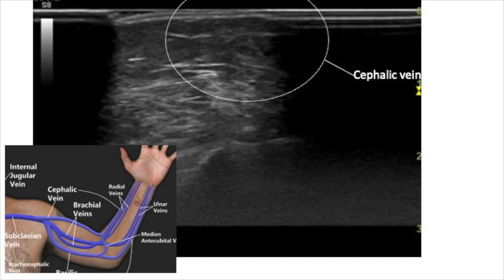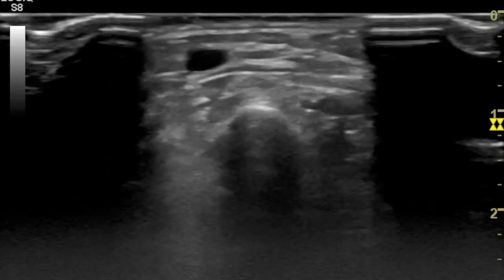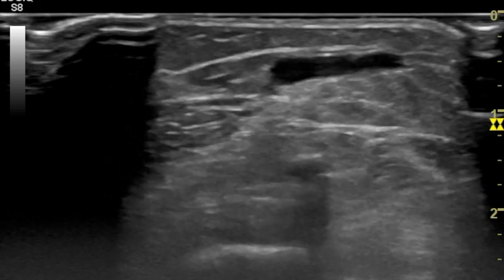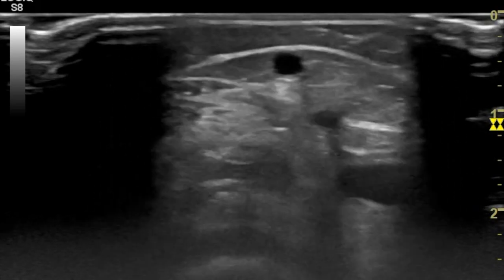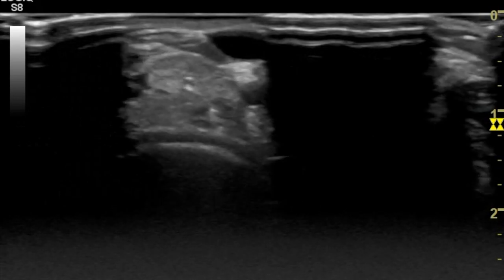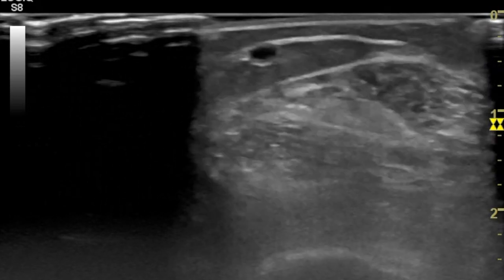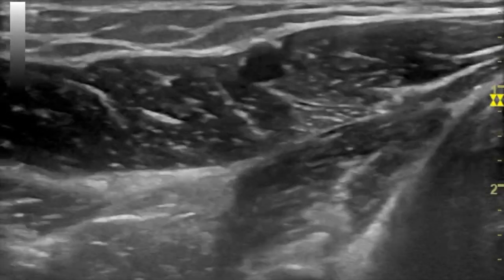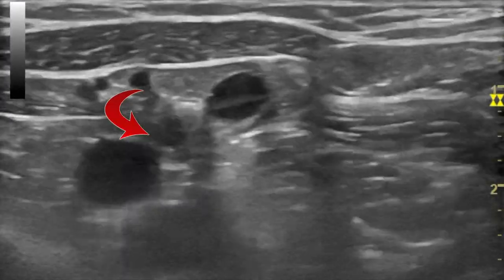Coming on to evaluation of the cephalic vein and the basilic vein first. Superficial veins are very easy to identify. The cephalic vein is seen coursing along the dorsum of the forearm, and one should include a proper B-mode evaluation in which you use copious gel. Try with minimum compression so that the vein is not compressed as you evaluate, and in B-mode, compression until the lumen is completely obliterated rules out any thrombosis. That's how a normal cephalic vein is to be evaluated, tracing it as much proximally as you can, and further continuing into the arm where you can see it goes deeper, pierces the fascia, and subsequently enters the subclavian vein.